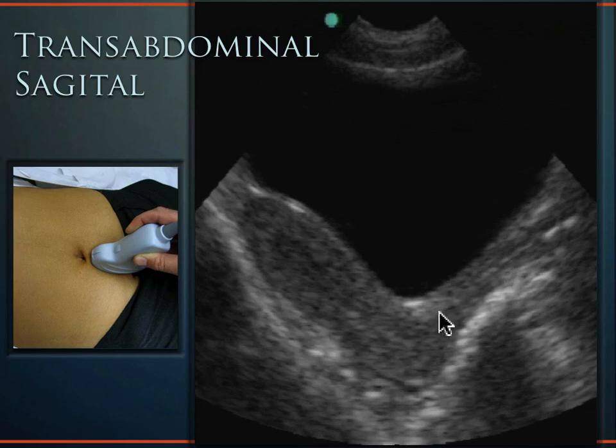and you get an echogenic line like that. Okay, so going from the outside world into the vaginal vault, you terminate at the cervix, and then you have this sort of 90 degrees where the uterus comes off that way. That's the anatomy there. It's a little confusing at first, but over time it makes sense.